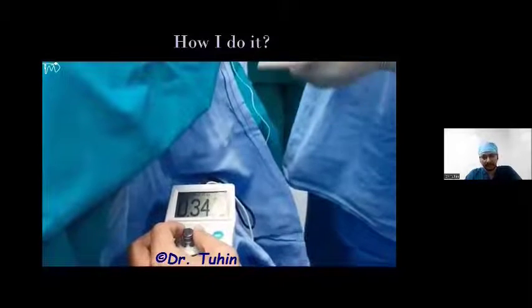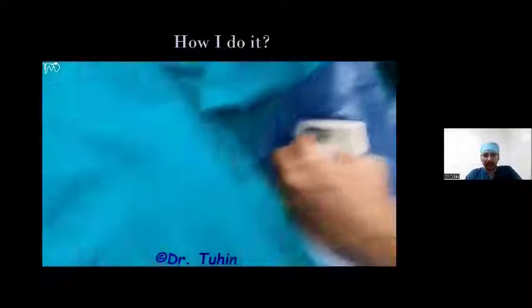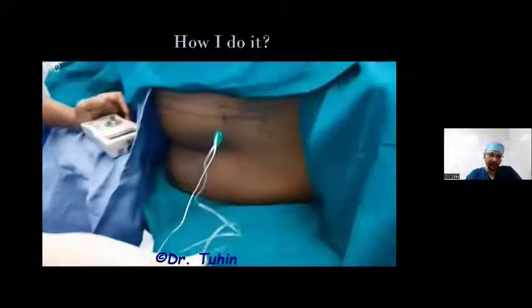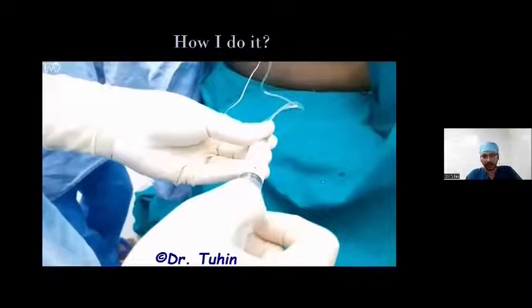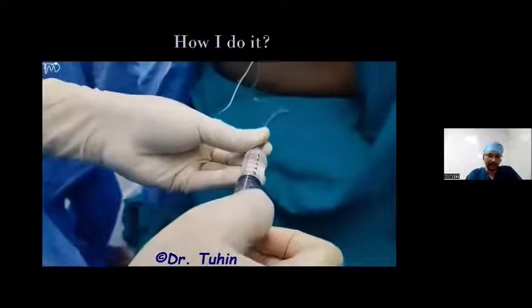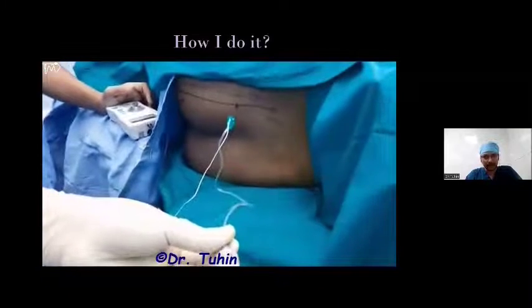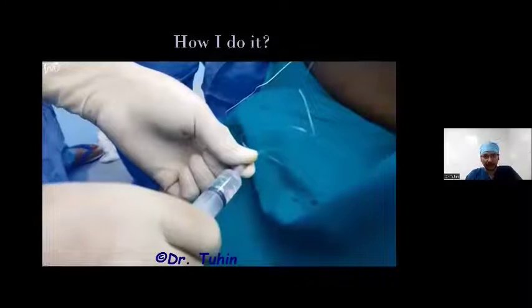So even on aspiration, it may get collapsed and you may not detect the intravascular placement of the needle. So this practical point you need to remember. That's why I keep it open. If it is inside the blood vessel, immediately it comes out. So once you get the desired twitches at less than 0.4, just aspirate and inject.